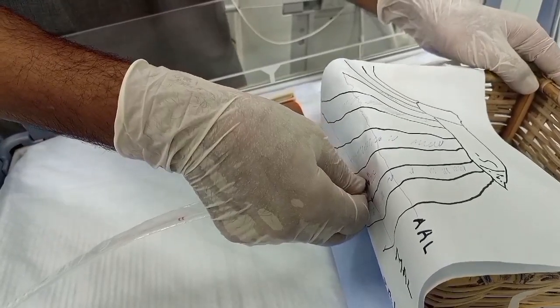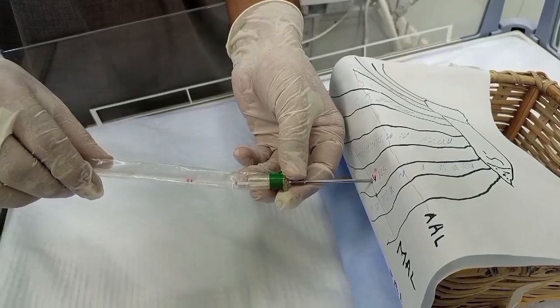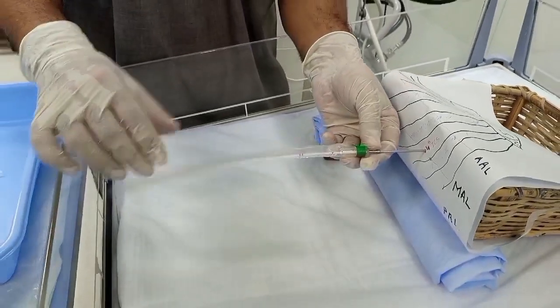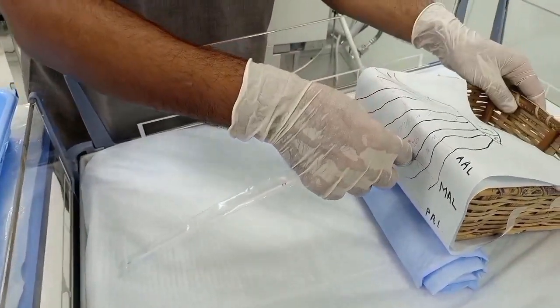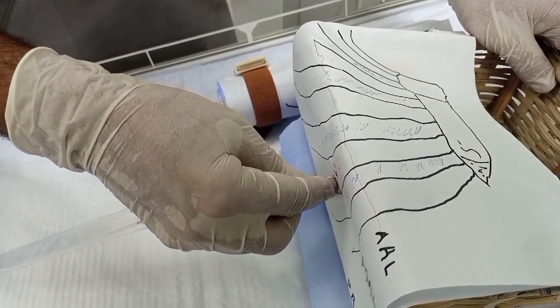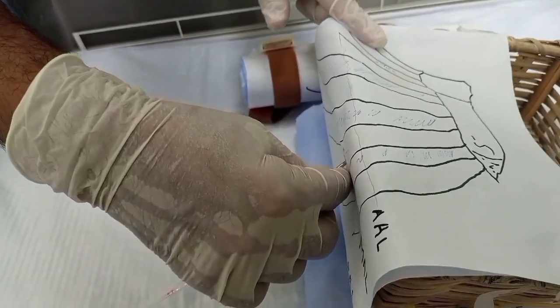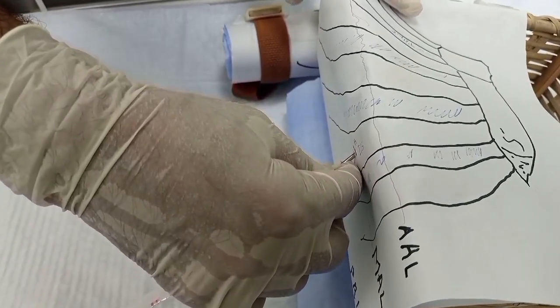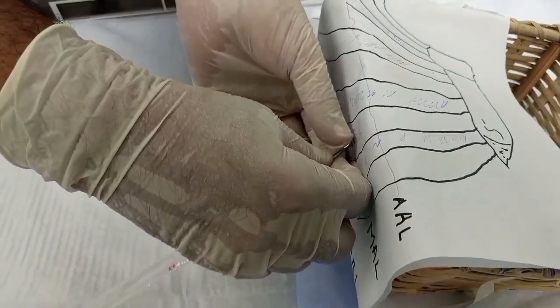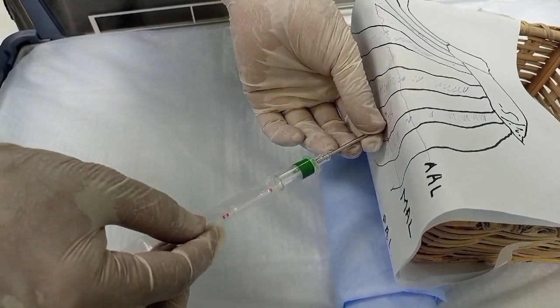As you enter the space, you will feel a giveaway and can see the air coming into the barrel. After confirming you are inside the pleural space, redirect the needle towards the mid-clavicular line on the same side as the affected chest, then insert and push the catheter forwards.